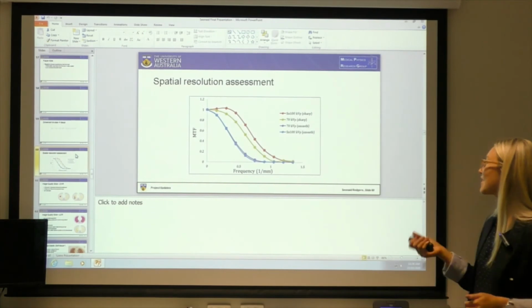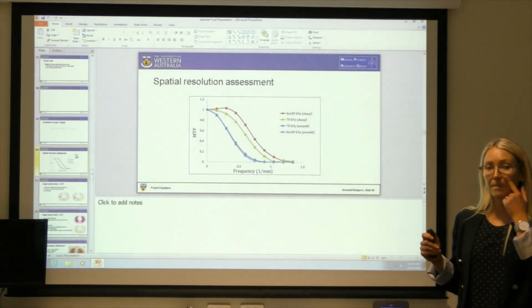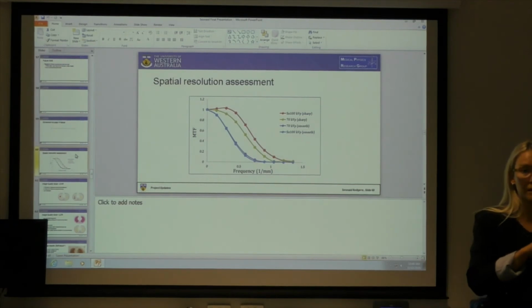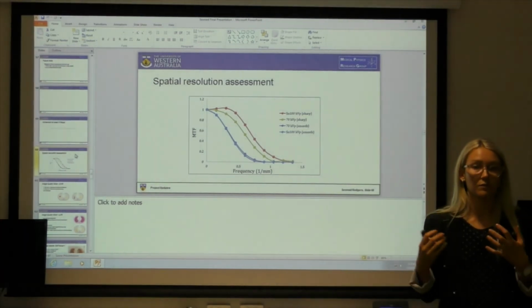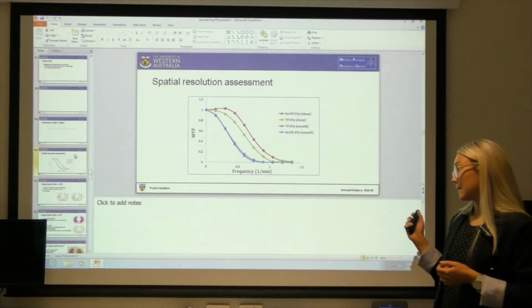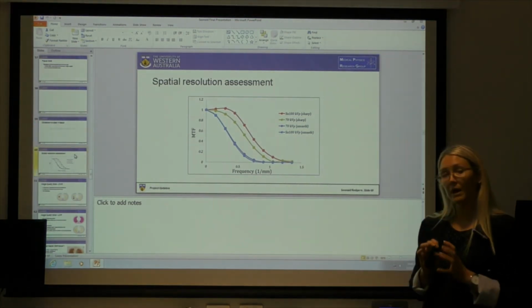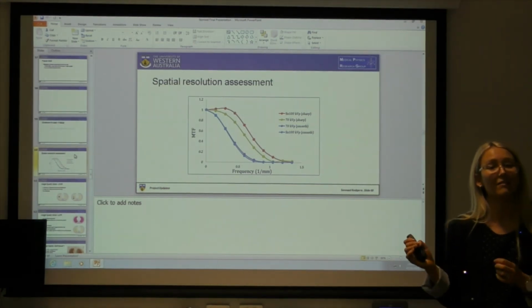It's very prepared. But it's good because it's good resolution at lower dose. Yeah, so you can see that the resolution for the smooth images is less than the sharp images, which is expected because it's a smoothing filter, so it's blurring some of the detail there. But better than the 70, which is also good. For the smooth recons, they're about comparable, but for the sharp recon, the tin seems to have a better MTF.